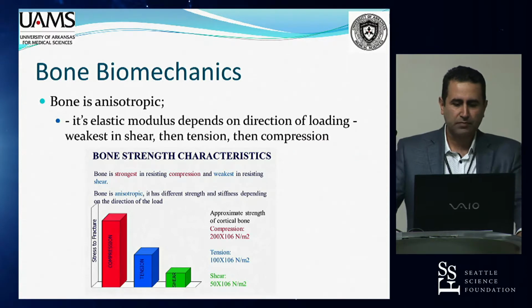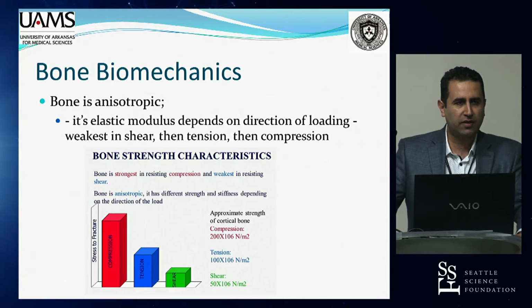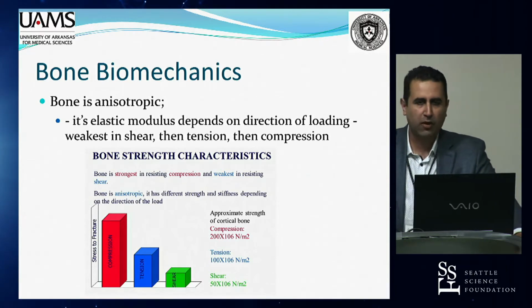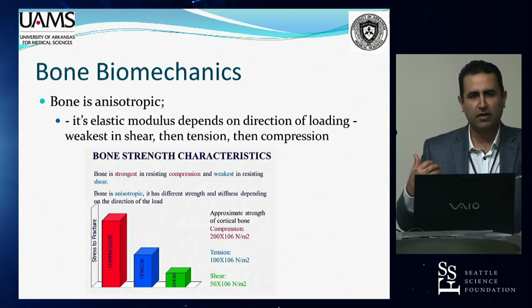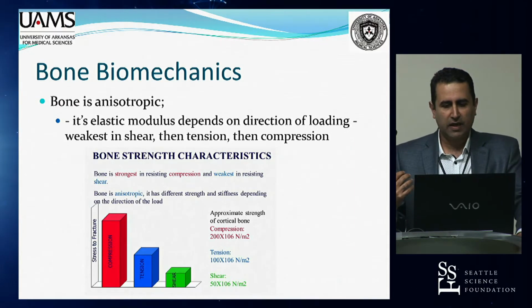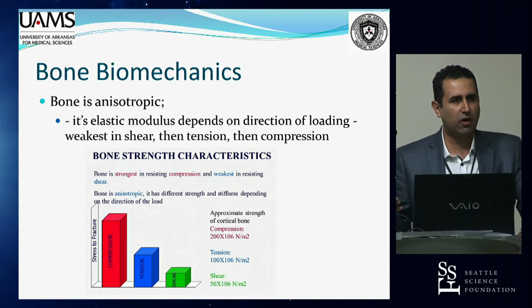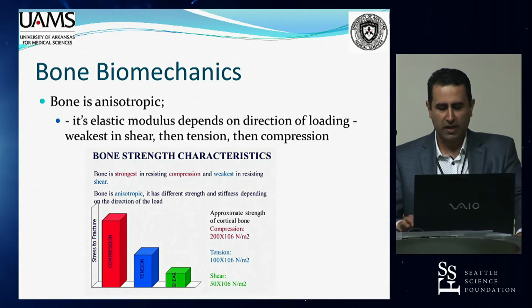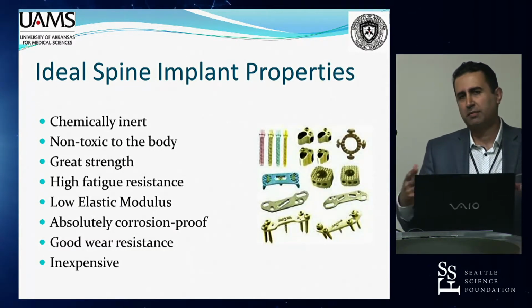And so that's a consideration too when it comes to fractures, firstly, and how we would expect the bone to withstand a compression fracture versus a shear injury. But also the modulus and the stiffness of the rod, of the construct that we're going to place. So we've talked about the basic biomechanics of it.